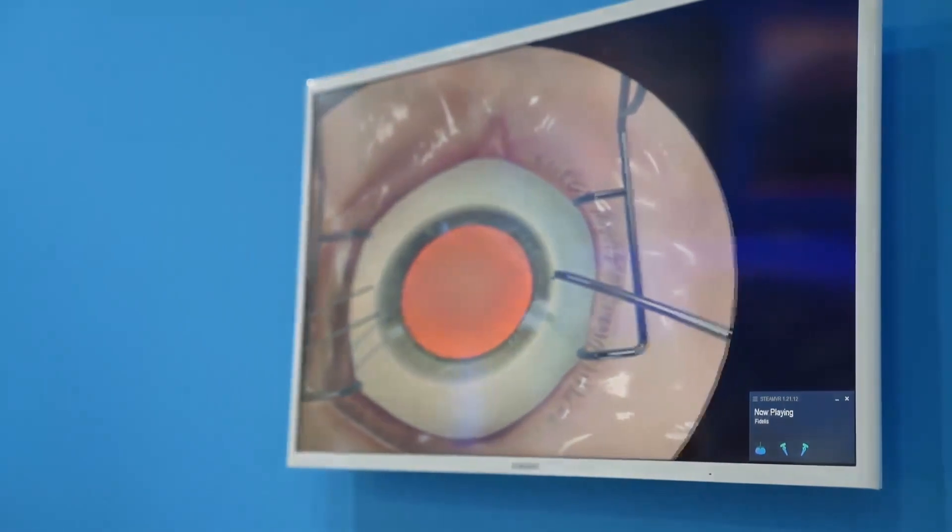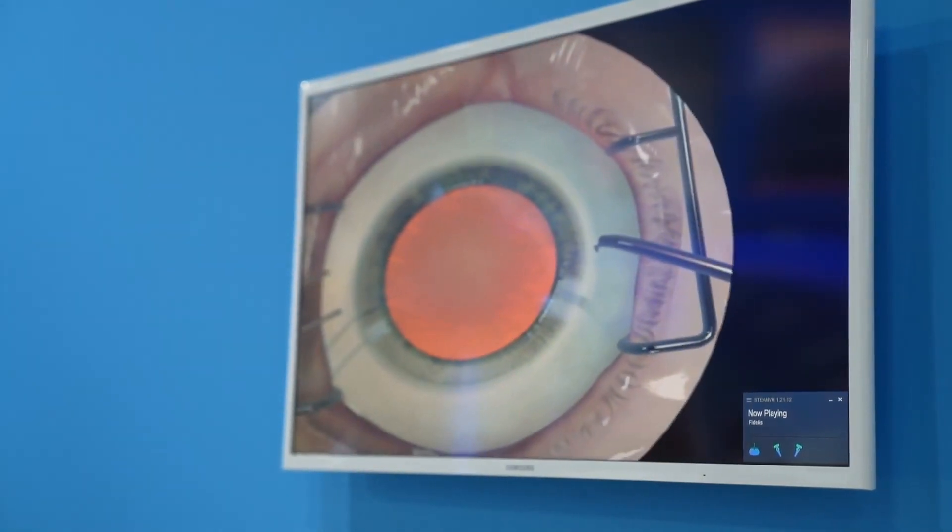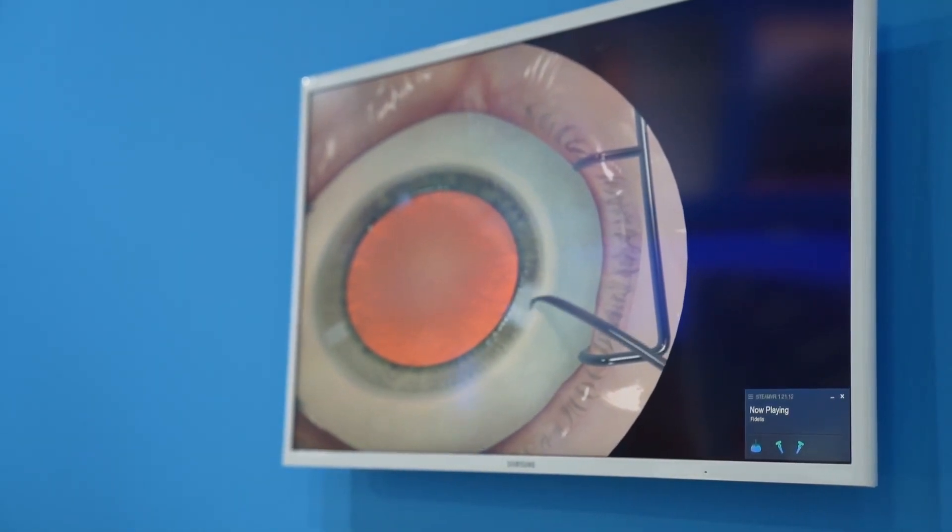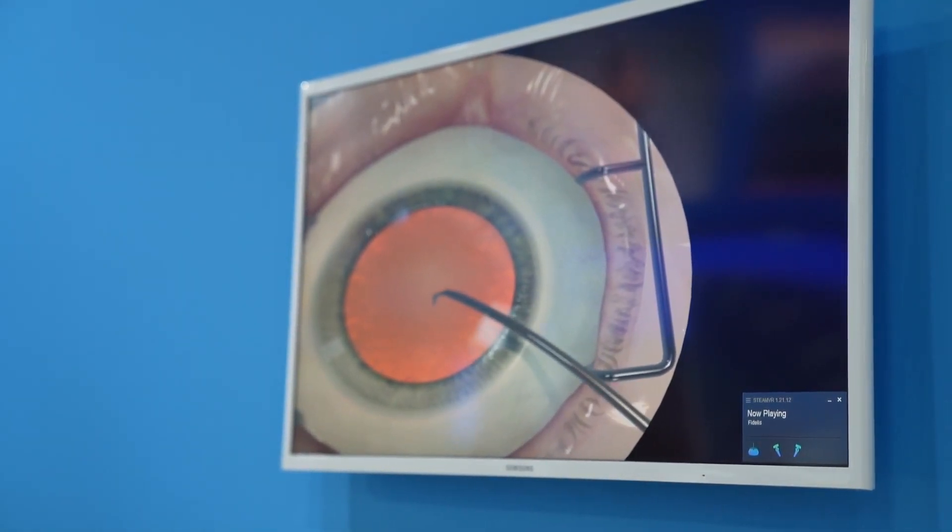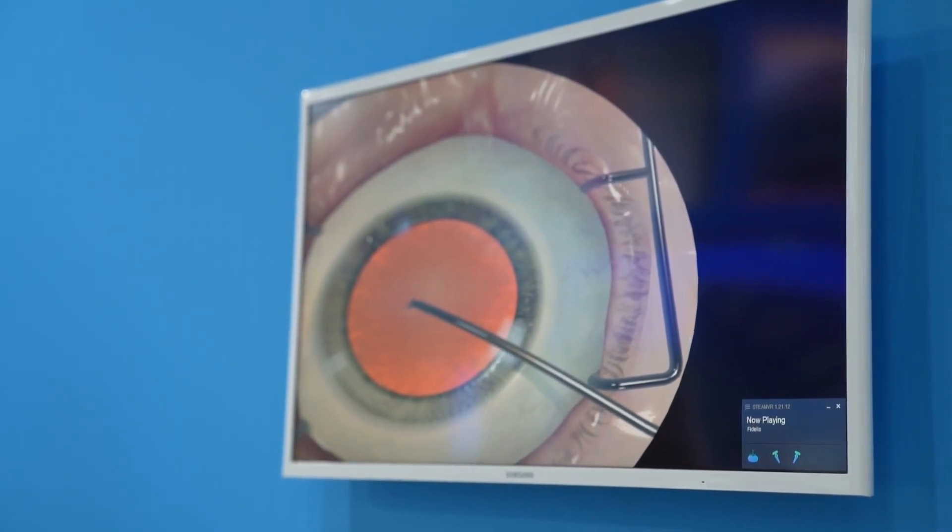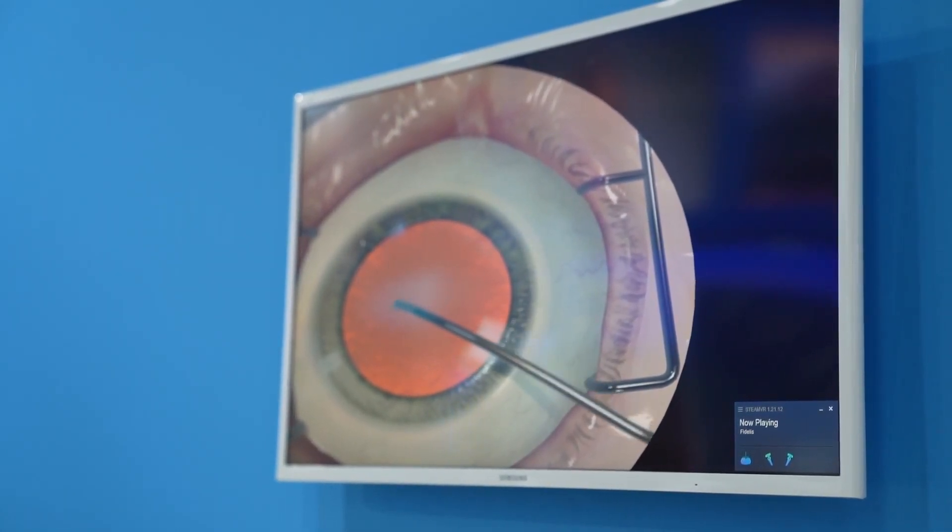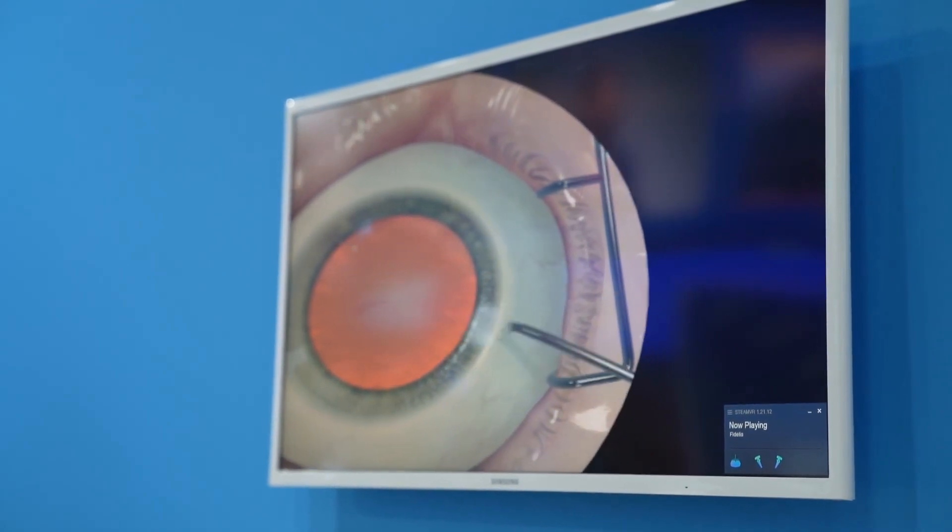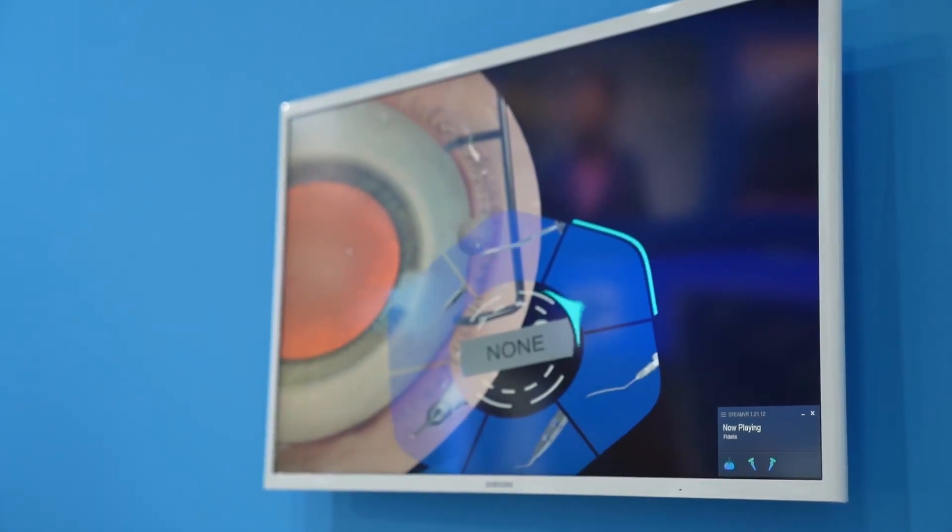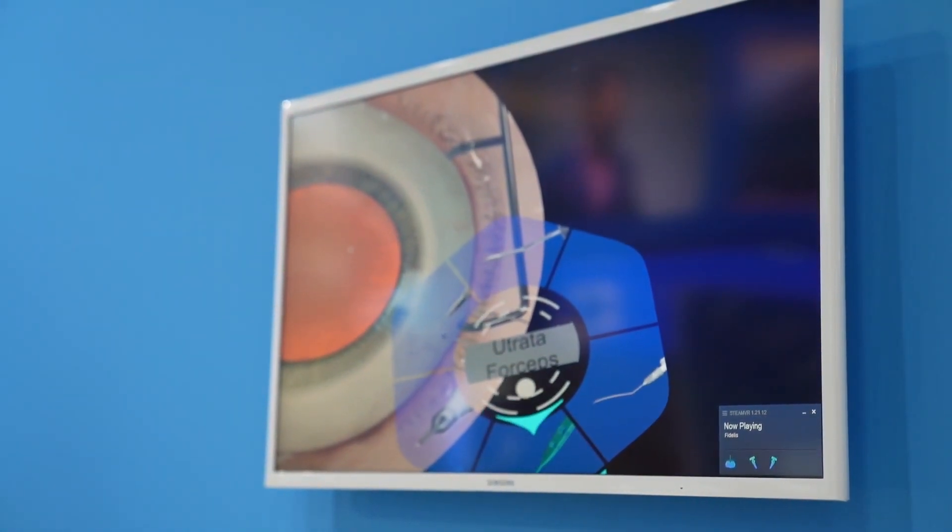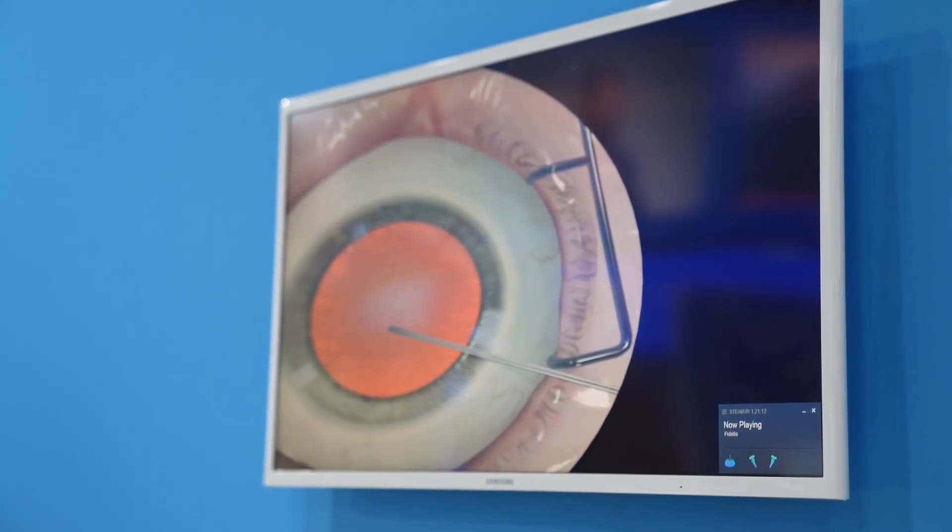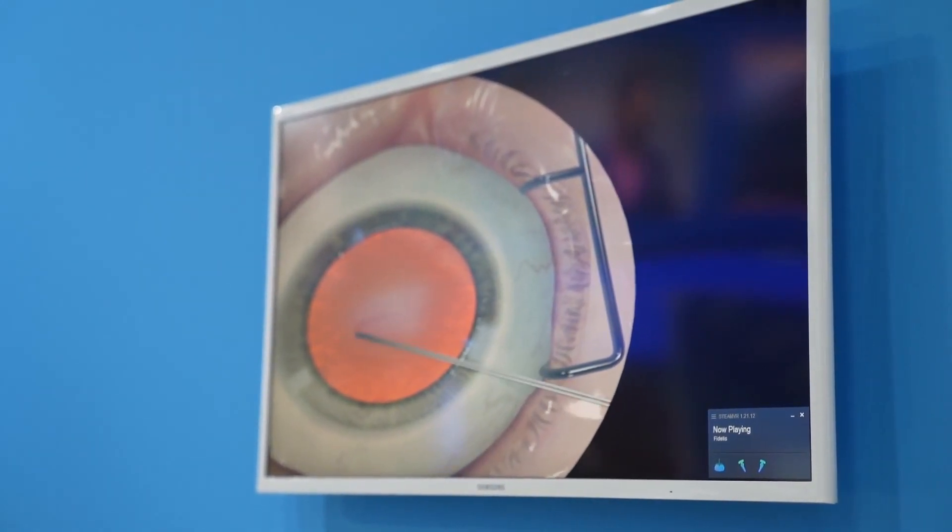We can move forward. Now we'll create a capsule rhexis. Stabilize the eye, create a small incision with the cystatome. With the back button, I can dial around and select the Utrata forceps, close the forceps, come in and grasp.